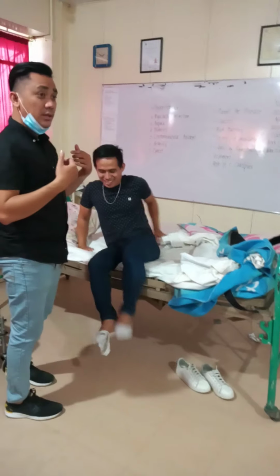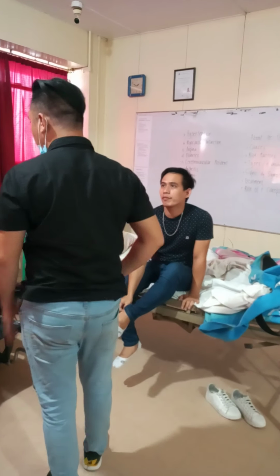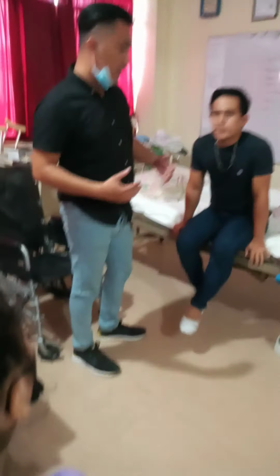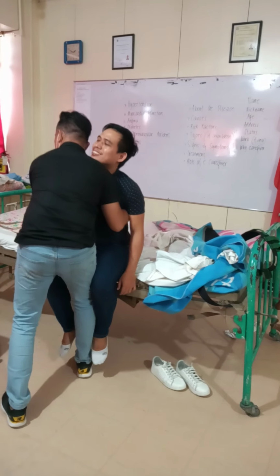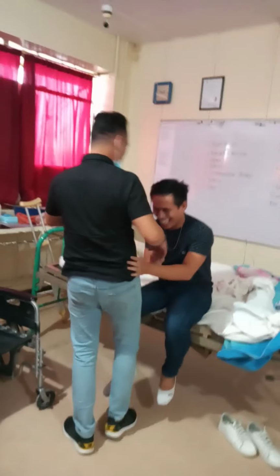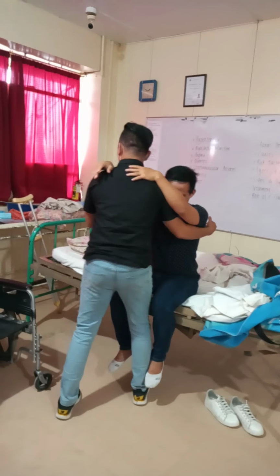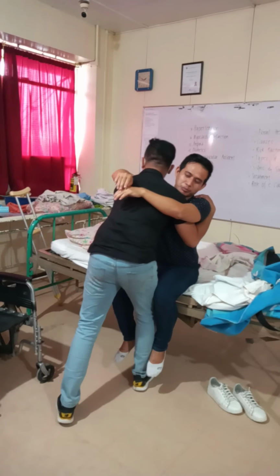Okay, now, what if there is no gait belt? How do we handle a patient without a gait belt? Do we use the materials available? Hold him, sir. Holding is okay, but the problem with holding is that you may slip. Gait belt, then here on the shoulder, sir. The count of 3, 1, 2, 3, stand.